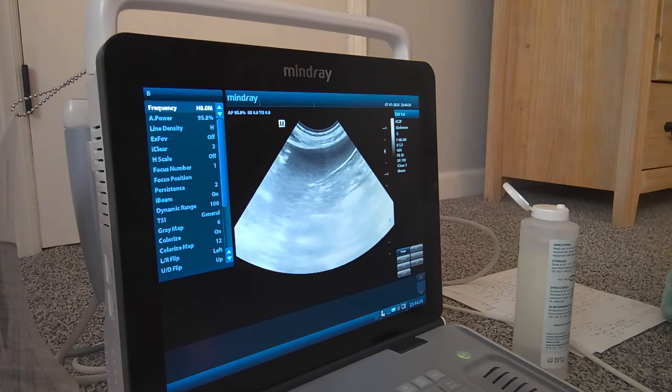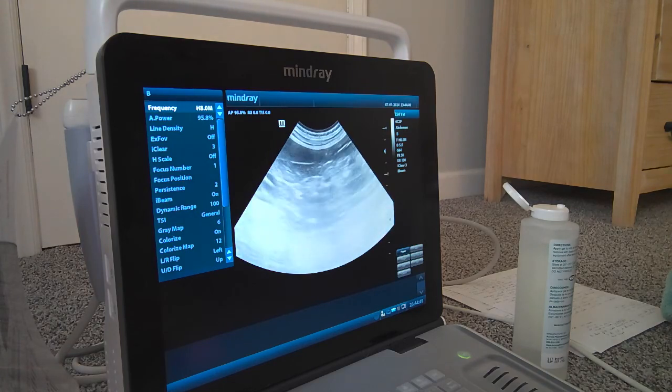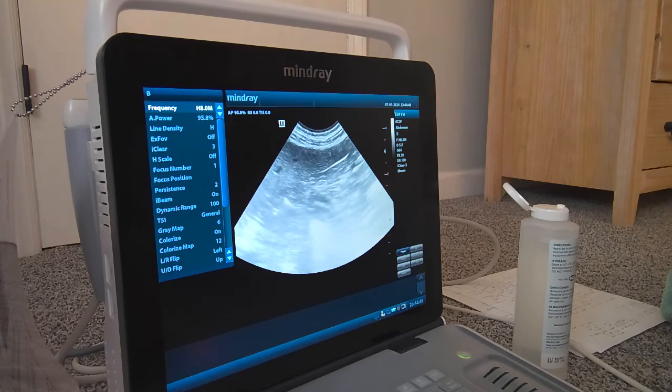Cats sometimes will actually have little accessory spleens. So if you can see the whole spleen, sometimes you might find a little piece of the spleen down by the pancreas or something. They're just kind of cute. They're called accessory spleens, and that can be normal. I think it's even up to 4% of cats. We can see some of those in there.